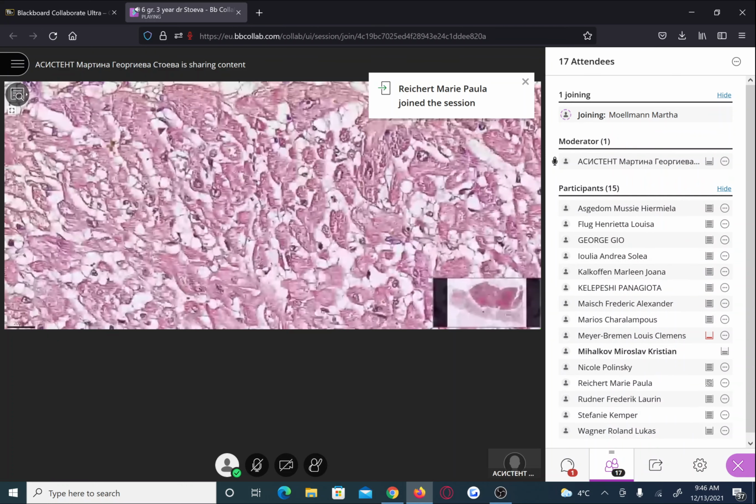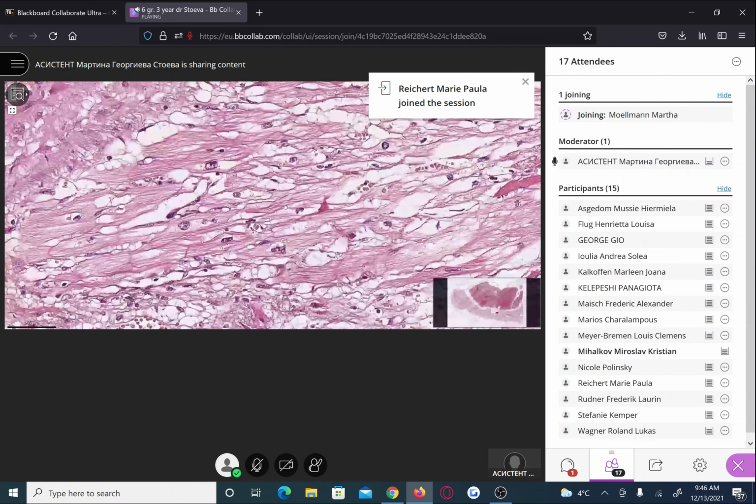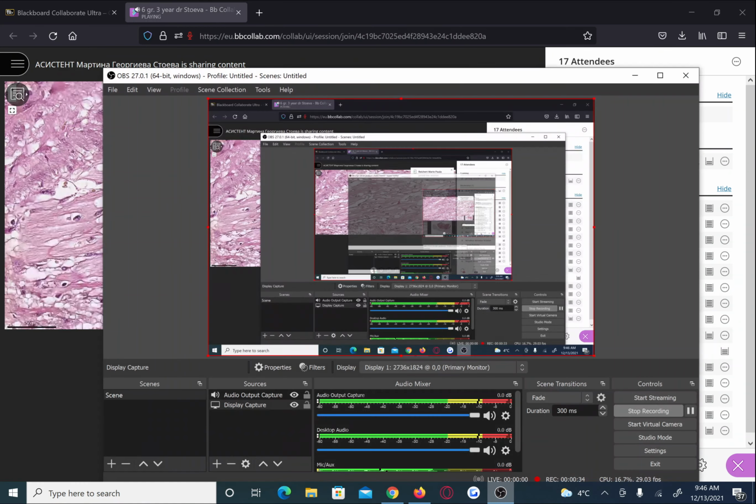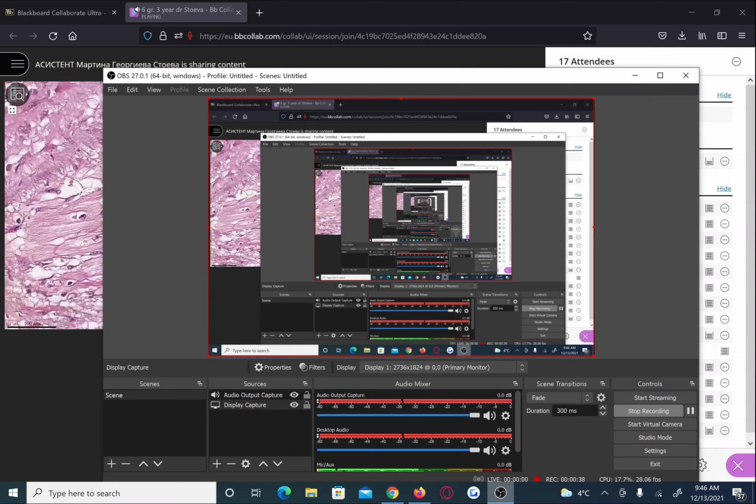I may try to find, here there is another area where we have a longitudinal section through the cells, so they are really long, and again we can find the nuclei of the cardiomyocytes in the central portion of the cytoplasm.